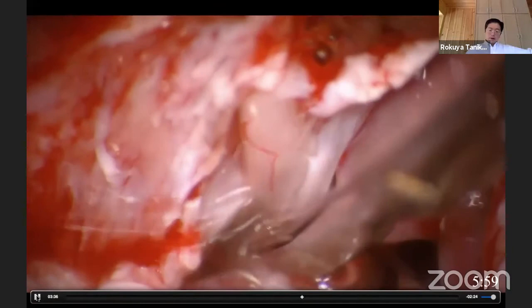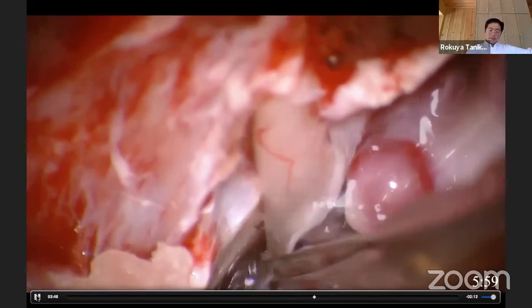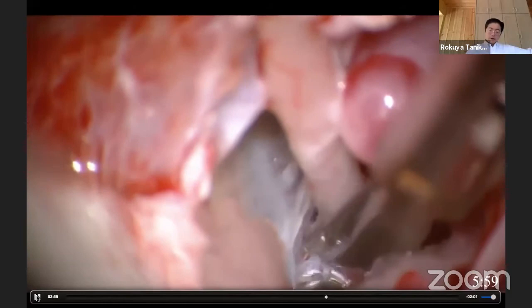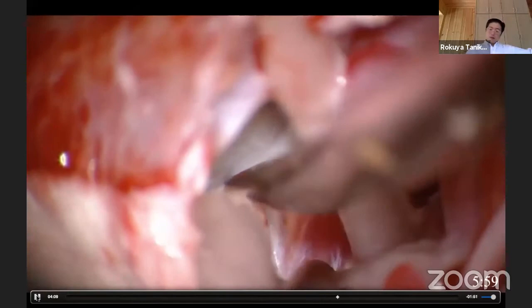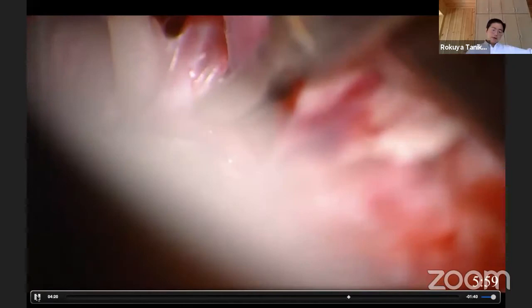Here is the cisternal oculomotor segment. The arachno-trabecular posterior to the oculomotor nerve should be incised, because by retraction of the temporal lobe the trabecula between the oculomotor nerve pulls the oculomotor nerve posteriorly and laterally, causing operative oculomotor palsy. So freeing the oculomotor nerve by cutting its anchoring arachnoid trabeculae is very important.